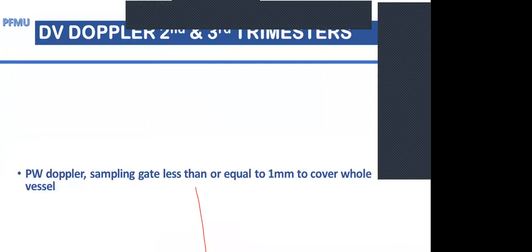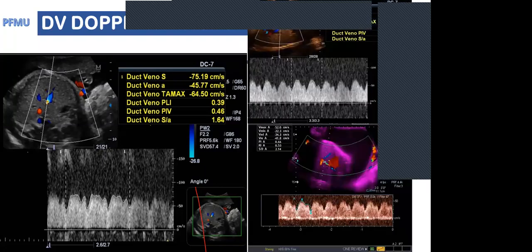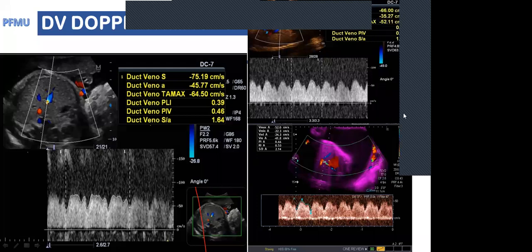Yeah, I think just a small addition concerning the ductus venosus is that, like we saw from the picture, in comparison to the IVC or any other adjacent vessel, we'll see aliasing. Even the color will not look like the other one, even in terms of the speed. So you'd find the other vessels, hepatic or IVC, maybe around 40 centimeters per second, whereas the DV would be around 80 to 100 centimeters per second. So once the speed looks a bit tricky, then you are more likely dealing with a different vessel. Then just based on your sight, if you see aliasing within that vessel, and based on the technique you've tried to precisely locate it, you can definitely tell that you are now looking at the DV. And of course, the characteristic of the waveform itself would tell you that you are there.